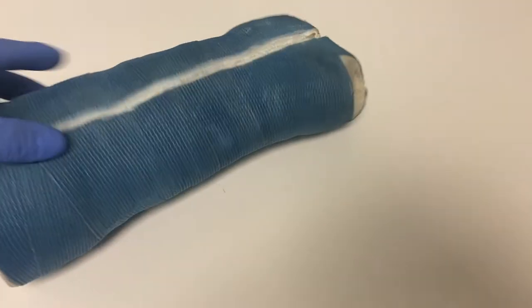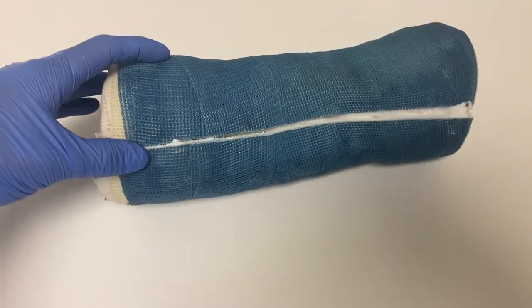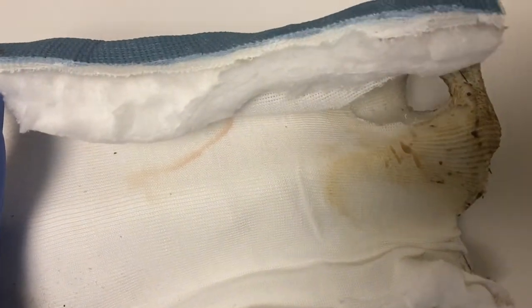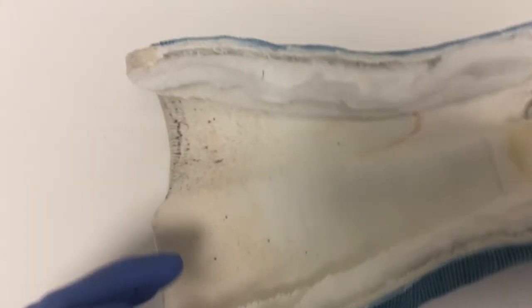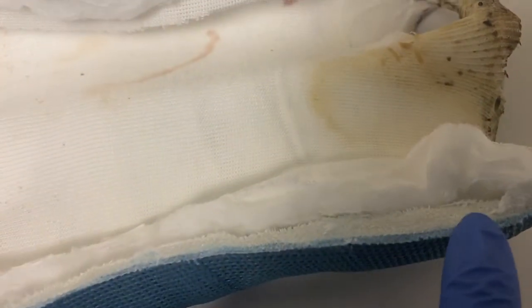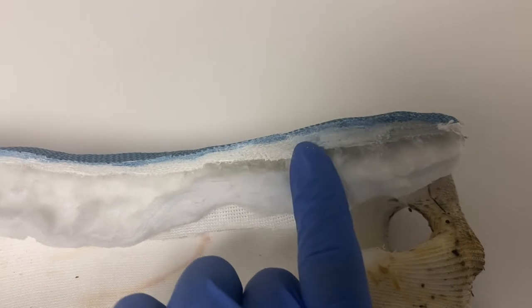This is a short arm cast that was on for four weeks. It was actually pretty clean on the inside — only a little bit dirty by the fingers, which impressed me. But it was a little thick when I was taking it off; I could feel the blade couldn't go through unless I pushed it a little further. Here I'm showing where the layers seemed a little bit thicker than in other places.